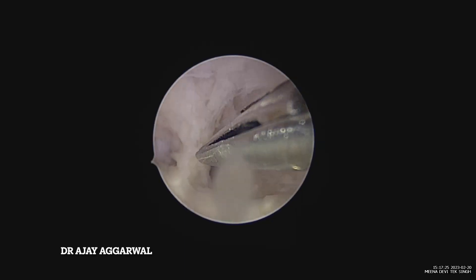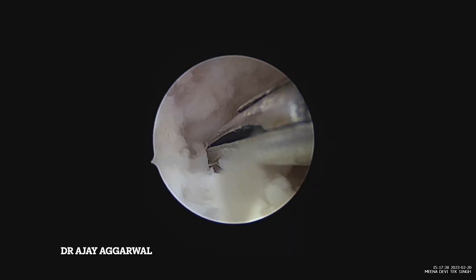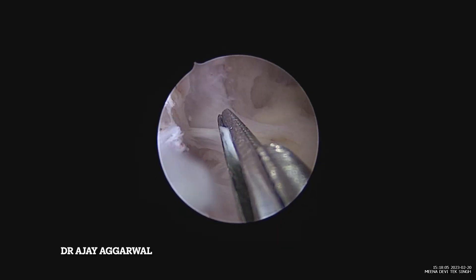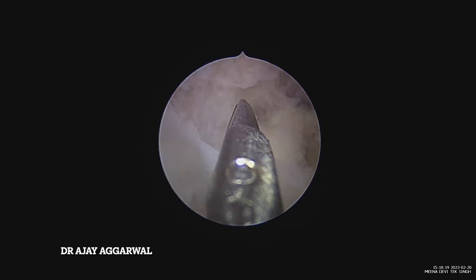I have almost reached the lateral wall, almost at the level of the ostia, because the plane and tissue are different over here. My dissection is almost complete towards the left lateral wall. Here you can see I am cutting near the fundus and I can identify the normal tissue at this level, so I stop. I don't dig further here — I want to finish dissection towards both walls first, then dissect at the level of the fundus at the end. After completion of dissection towards the left lateral wall, I am now going towards the right lateral wall.